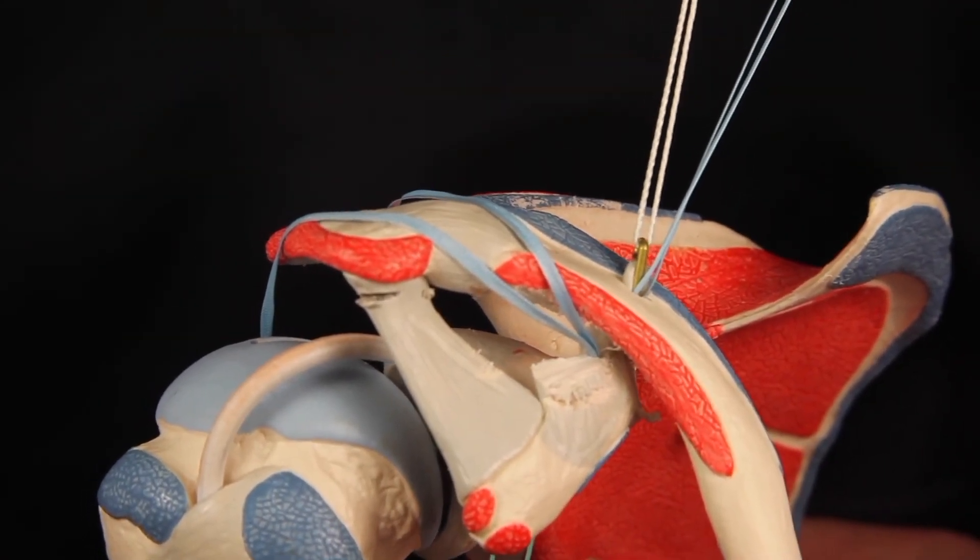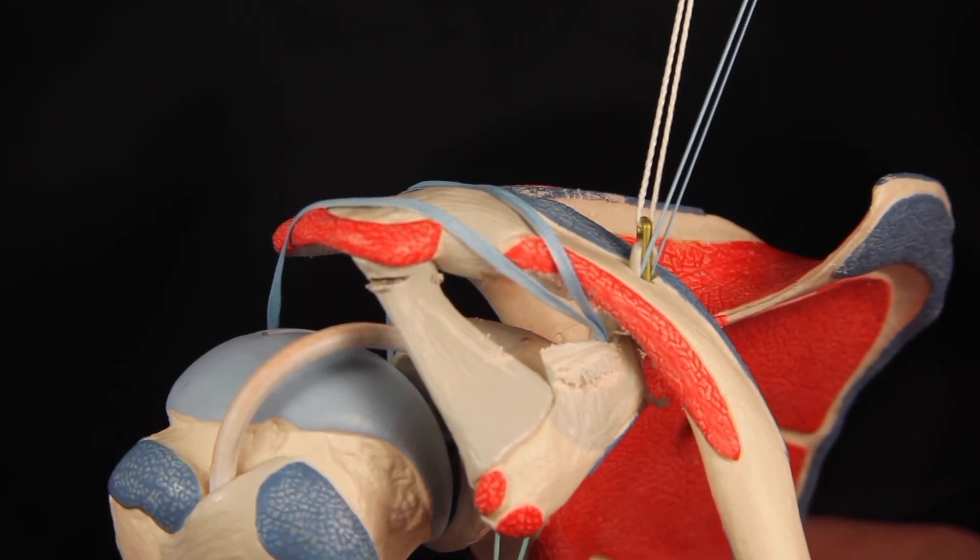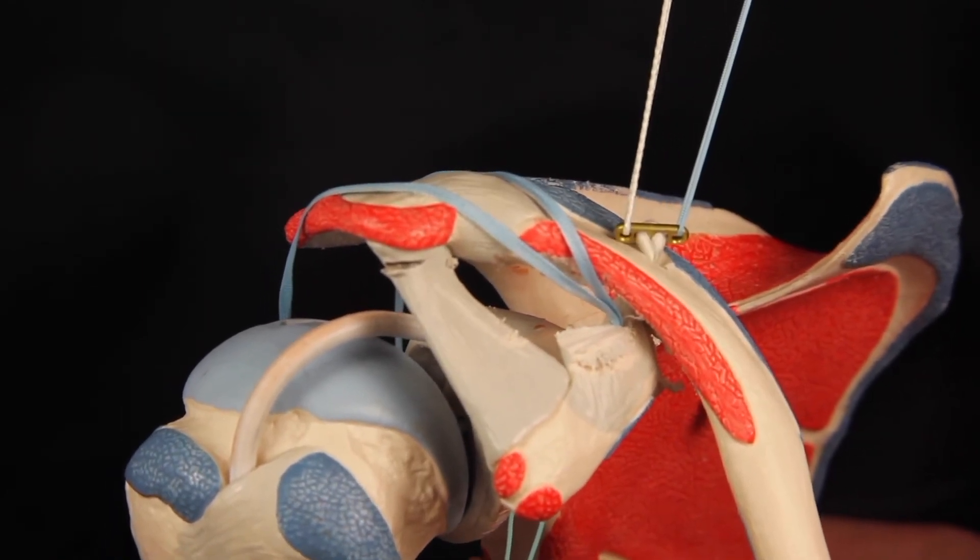Loop length can be adjusted by placing a washer or two onto the surface of the clavicle before passage and flipping.